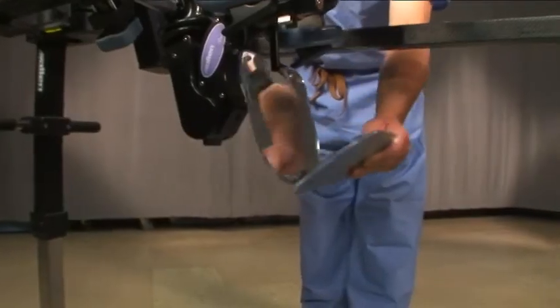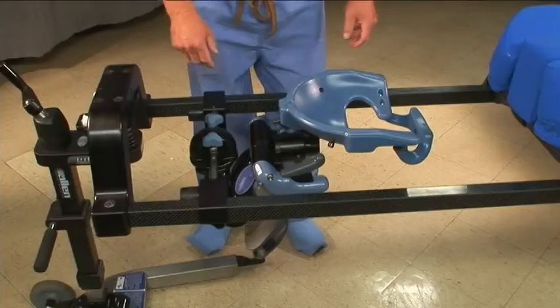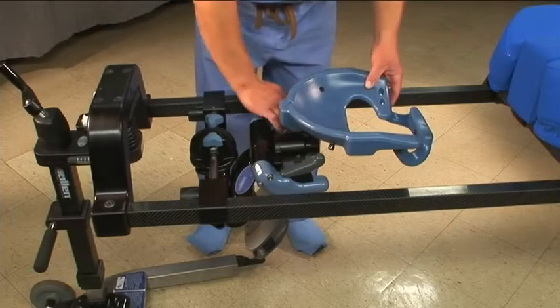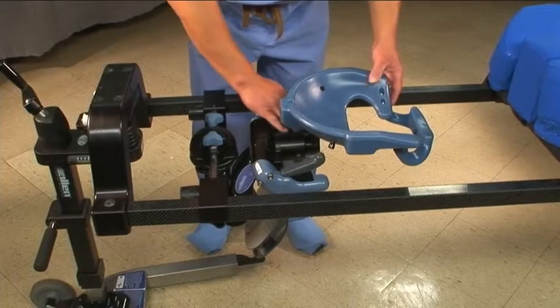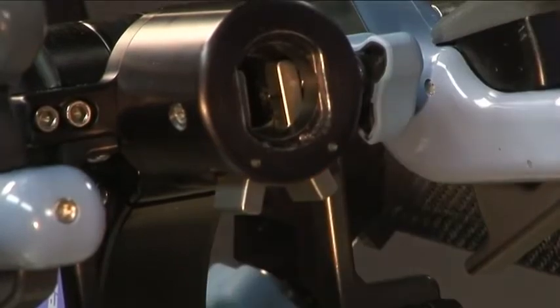The C-flex has a set of adjustable mirrors so that the patient's face can be monitored throughout the procedure. To remove a headpiece, loosen the knob on the side of the housing two to three turns. Squeeze the tabs under the housing and pull the headpiece straight out.